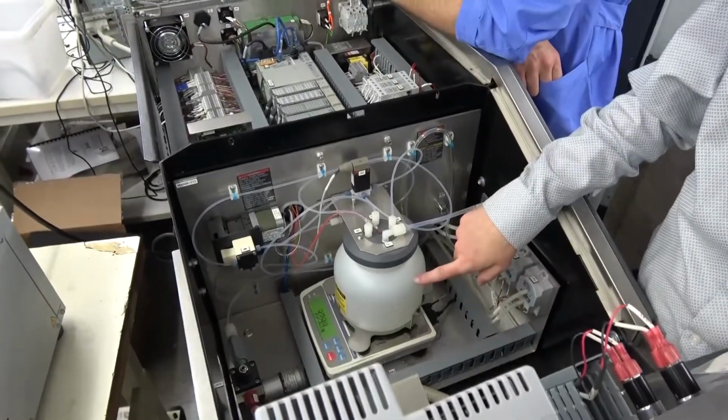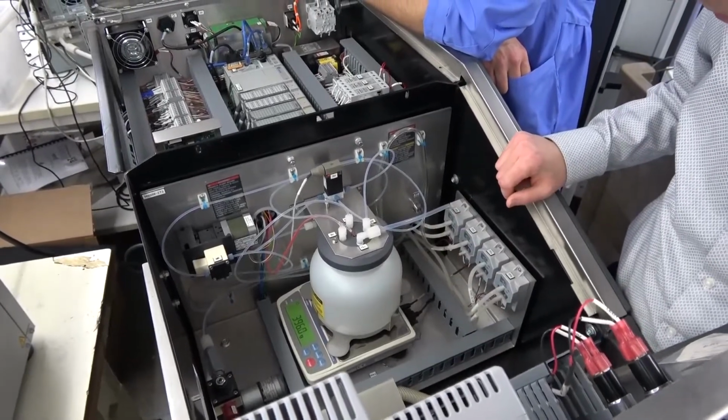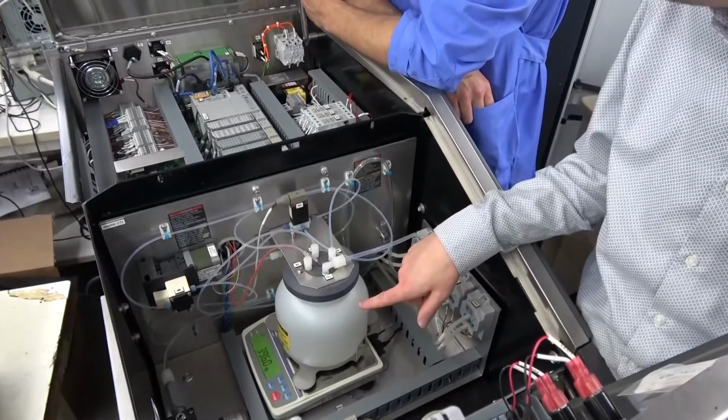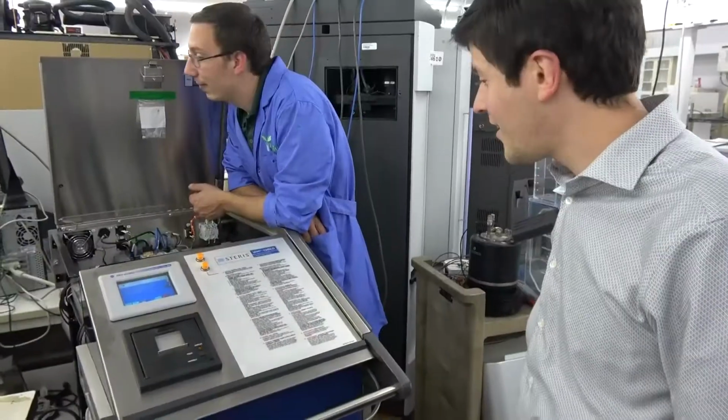So it pumps it into this and then it evaporates this? No, it pumps out of that as well. Pumps into that, but pumps out of that. Pumps in, then pumps out. So this is the most it can weigh at a time. It pulls it in there and weighs it and makes sure it's dosing it right. Okay, so there you go.